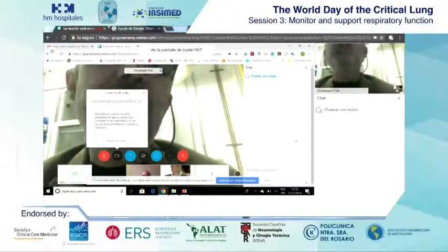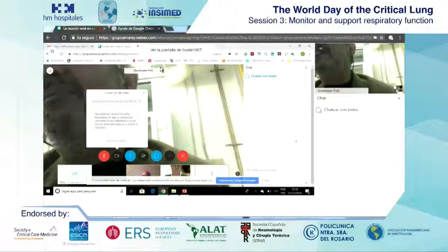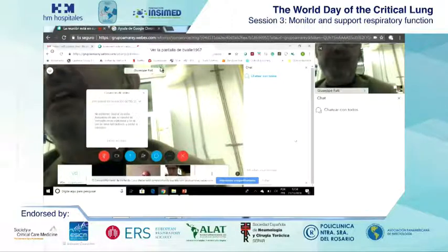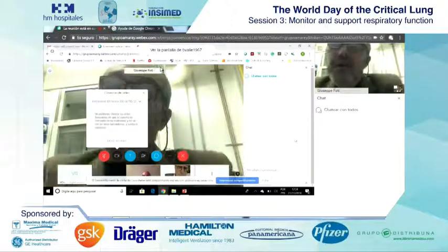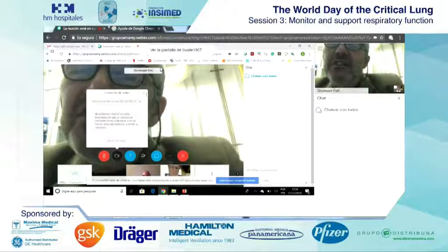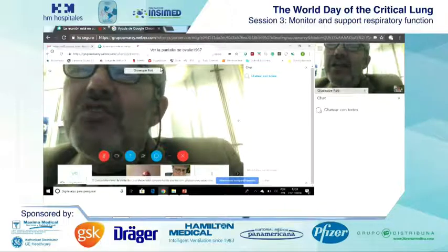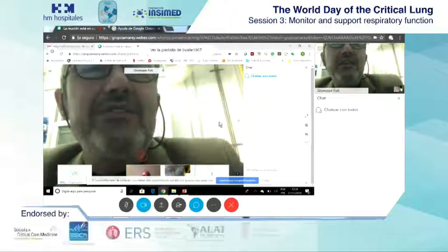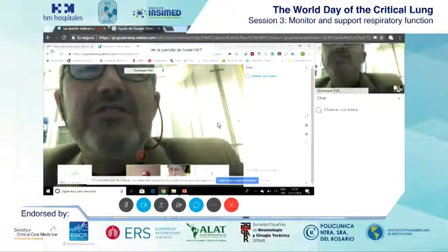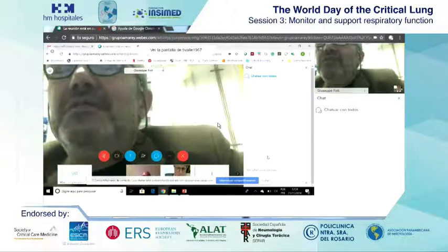I do believe recruitment measured by impedance tomography, beside the CT scan, is one of the best we have available, and it is also not difficult to achieve. Thank you. But also in adjusting the tidal volume, you could have a regional PV curve. And what is straight in lung compliance, total lung compliance, is not straight if you look at the regional part. Sorry for the prolonged answer.